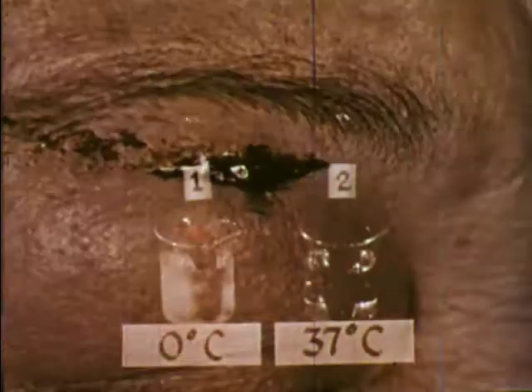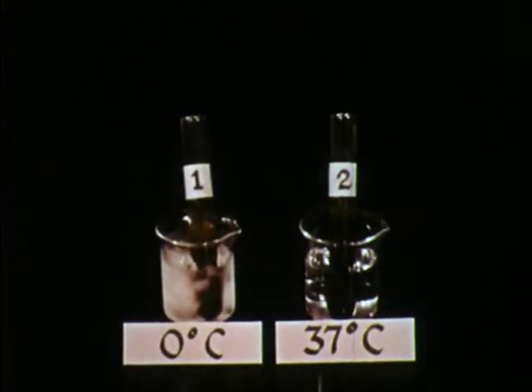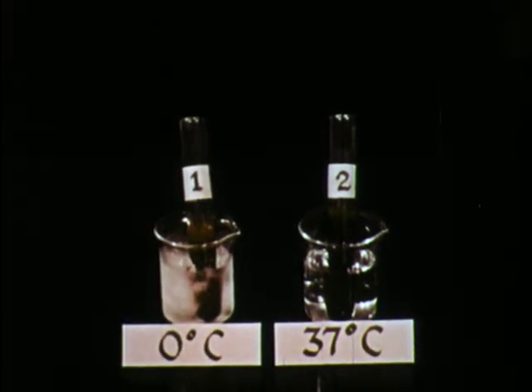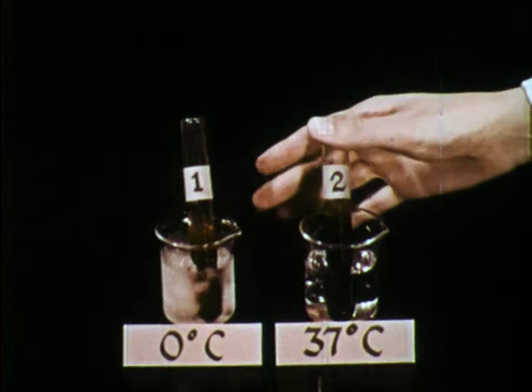When there is a flesh wound, a series of reactions takes place that leads to blood clotting. Blood clots faster when it's warm than when it's cold. This can be easily demonstrated. Here are two tubes of blood at different temperatures, one at the freezing point of water, the other at body temperature.